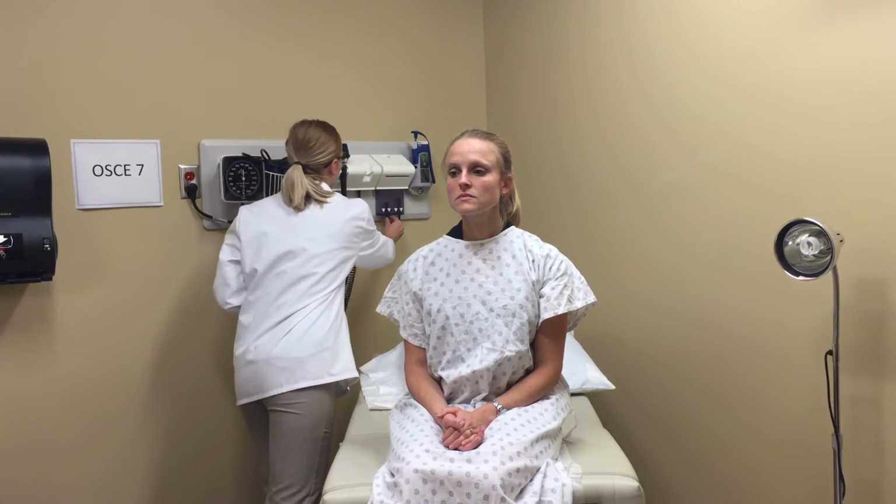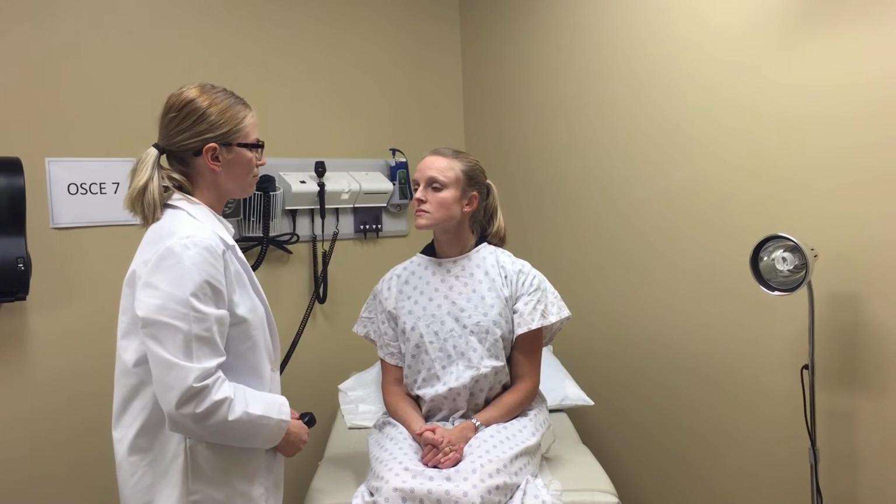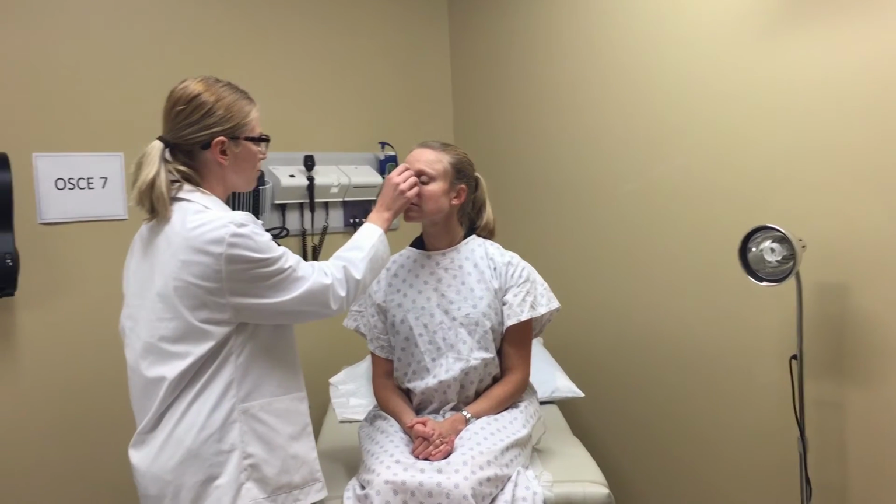We will now examine the nose. Inspect the external nose for bridge, asymmetry, lesions, discharge, and that it is midline. We will then palpate each side of the nose as well as the cartilaginous tip. Using a new tip, we can then use the otoscope to examine the internal nares.